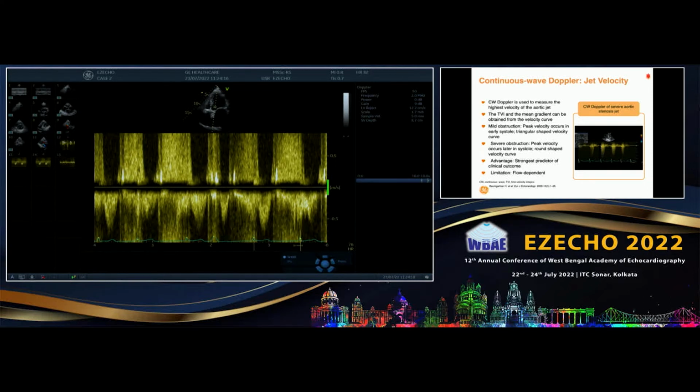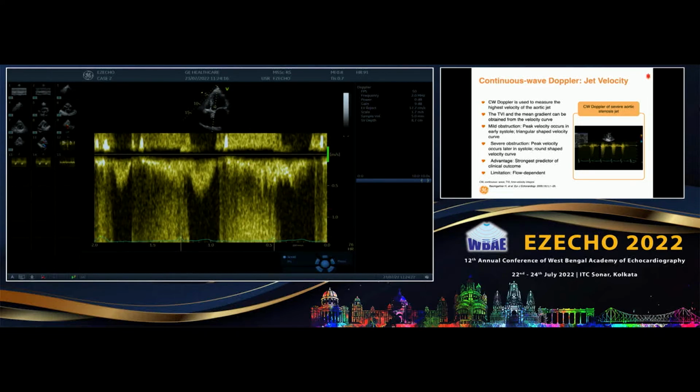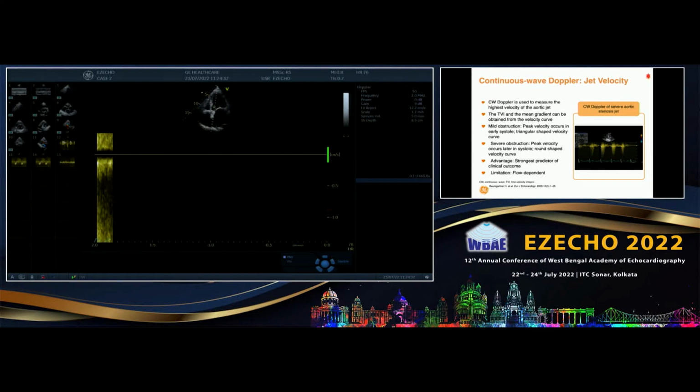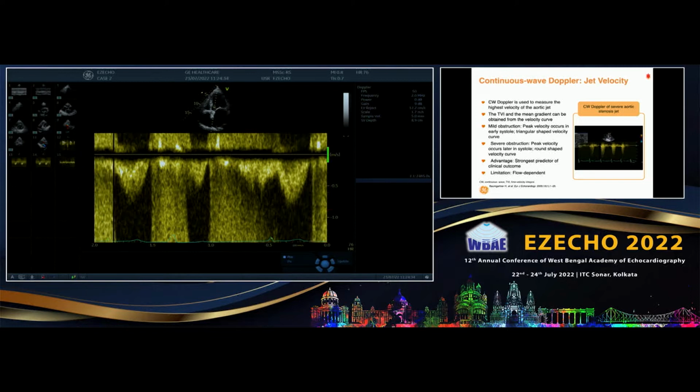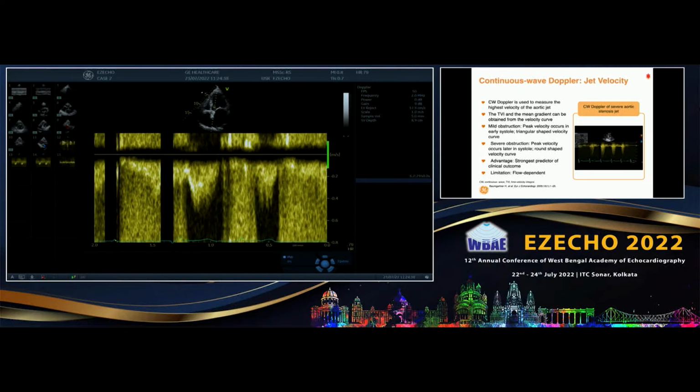So take the baseline up. Now I have a big real estate. Then I will reduce the peak velocity scale so that this comes down here, and reduce the velocity further, till it reaches almost here.